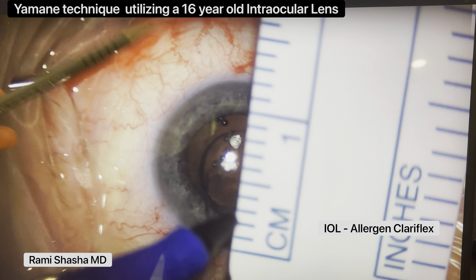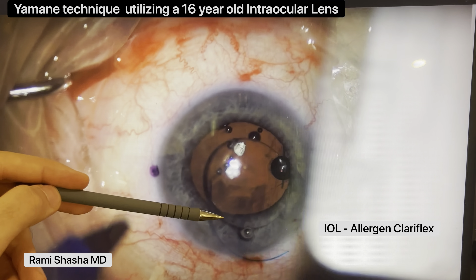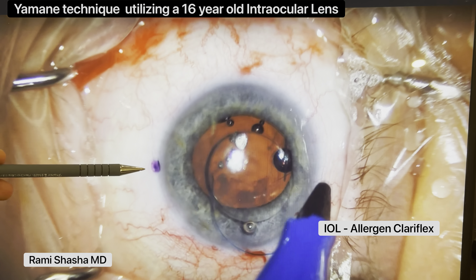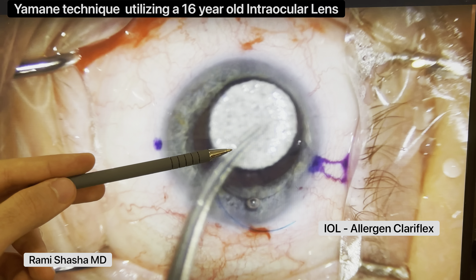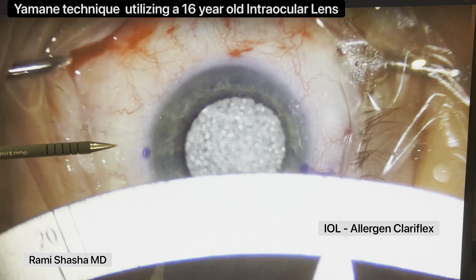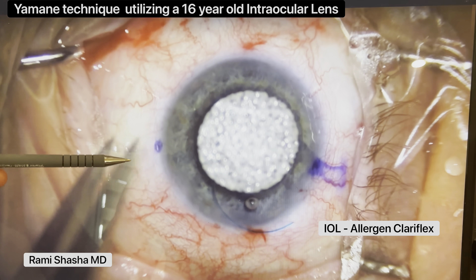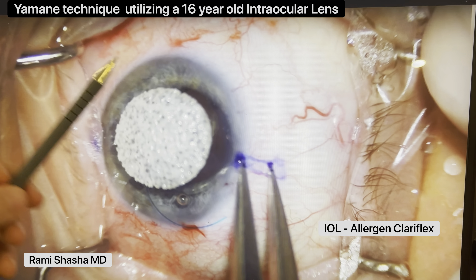Once I know that's the case, I know that the other haptic will be fine. Now I'm going to measure halfway across the corneal diameter, because this plays a big role with centration. I'm going to put a wet sponge to keep the cornea moist. I want the rest of the field to be dry, because I'm going to now place my marks two and a half millimeters away from the limbus, and then two millimeters across.